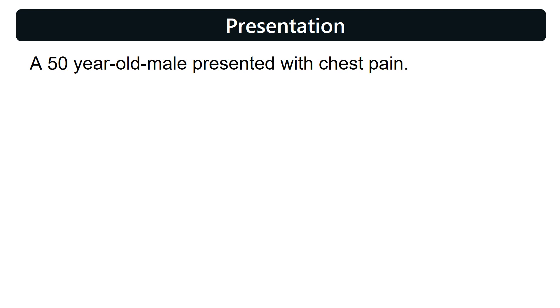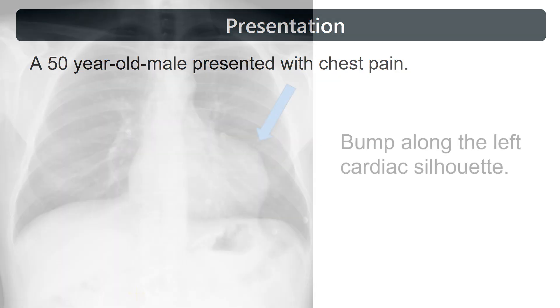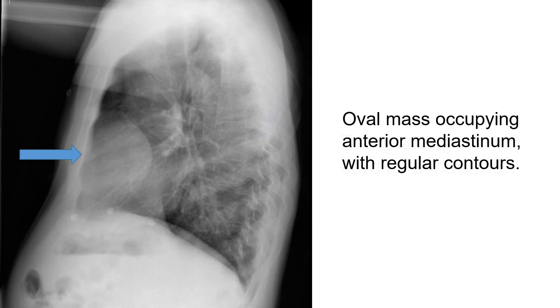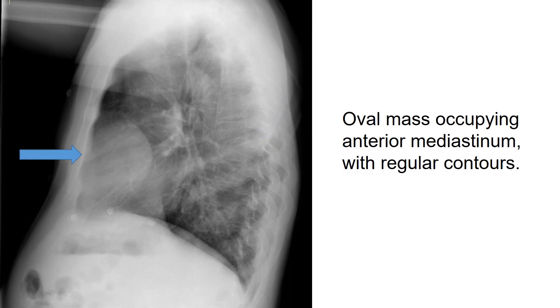A 50-year-old male presented with chest pain. Frontal chest X-ray shows a bump along the left cardiac silhouette. Lateral X-ray shows an oval mass occupying the anterior mediastinum with regular contours.